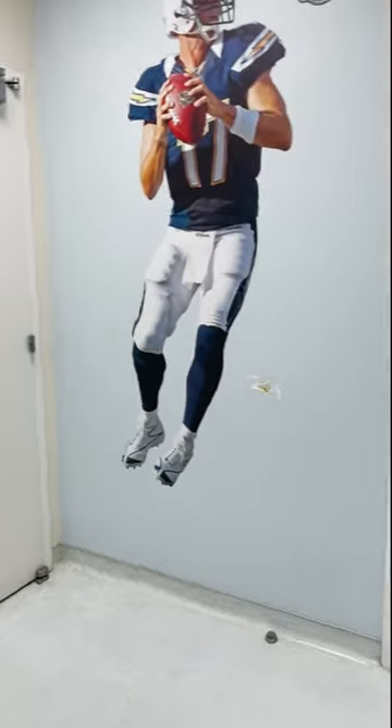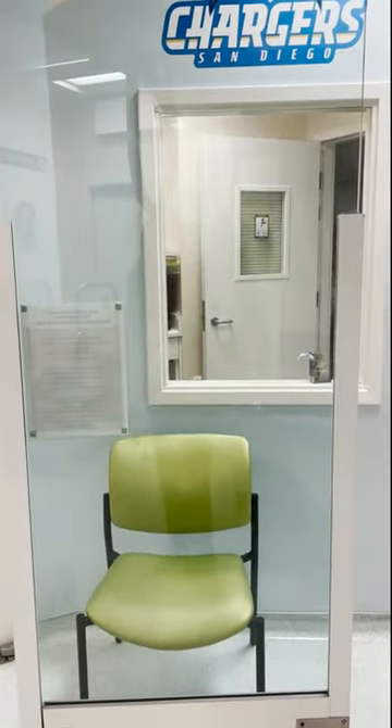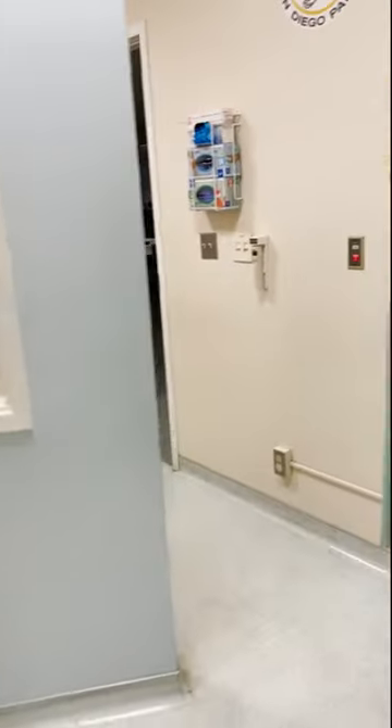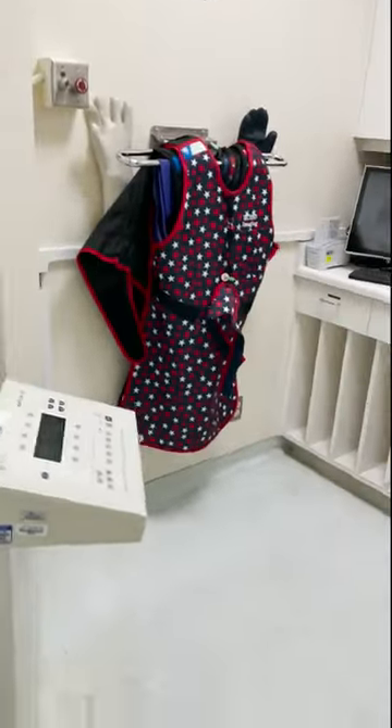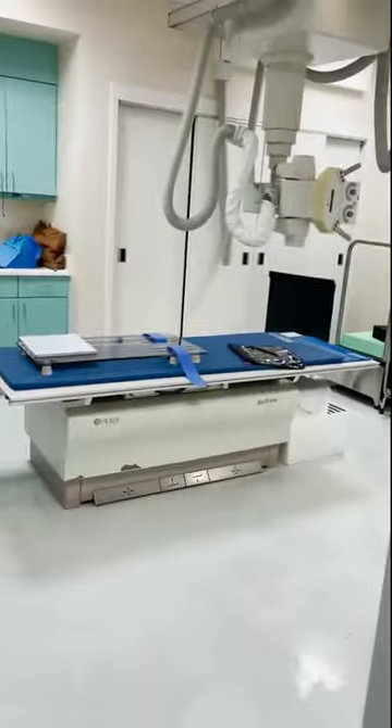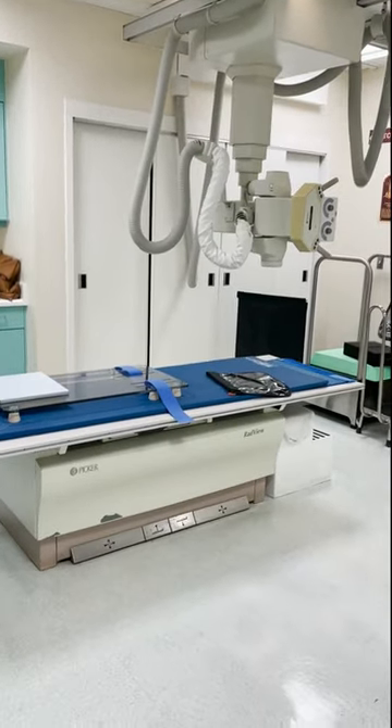While you are getting your x-rays done, your parents may be sitting in the corner of the room or in the protected seat, while the technician or radiologist will be behind the control area and they will be able to see you while you are getting your x-rays done.